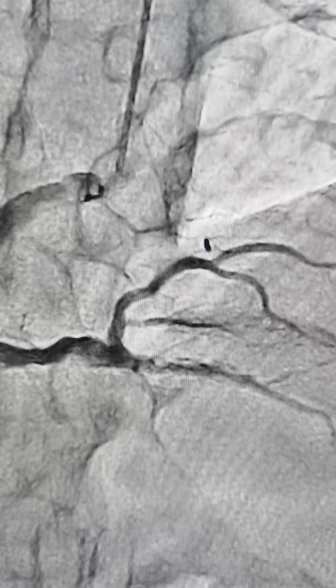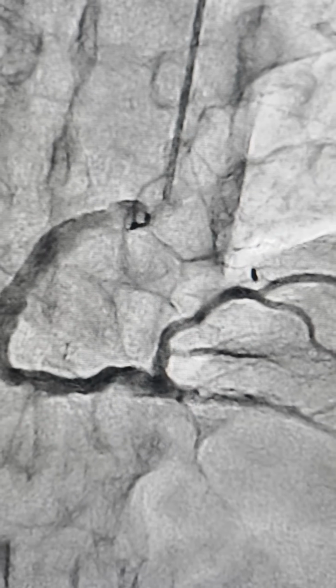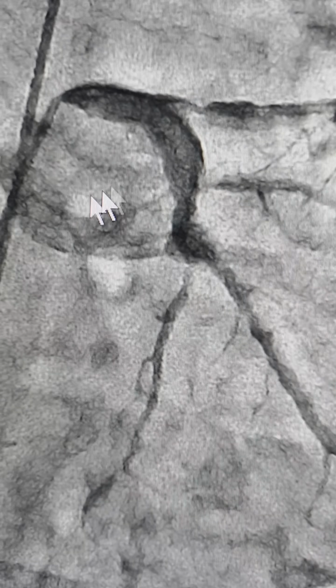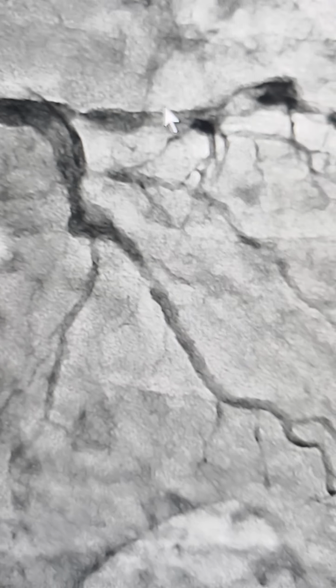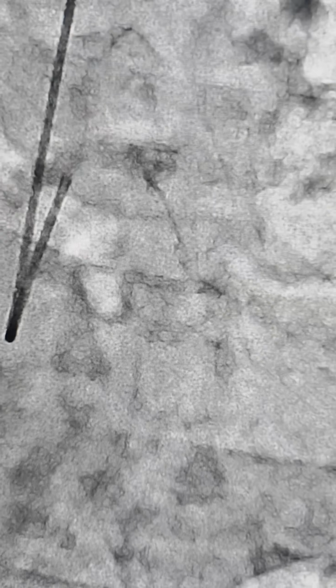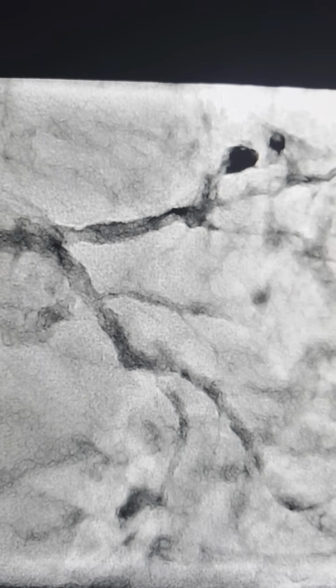The right coronary artery is relatively okay and is a little bit ectatic, and apart from that, nothing much. He is a non-diabetic, ex-smoker, 50 years back maybe. So the left system had a little bit of narrowing in the left main, nothing much. There was some narrowing here and in the LAD, and a severe narrowing. This narrowing we thought was not very severe looking at it in some directions, and so we didn't think that this was very severe, this one here. The left main, we again looked at it in other views.